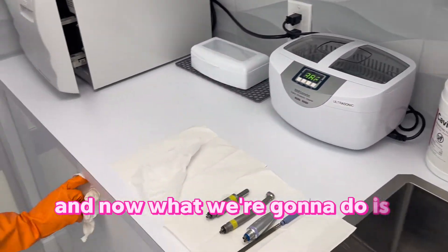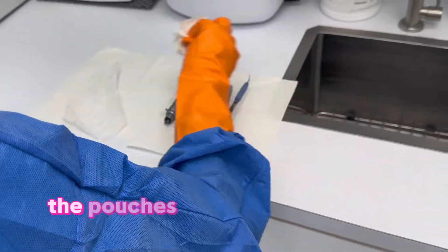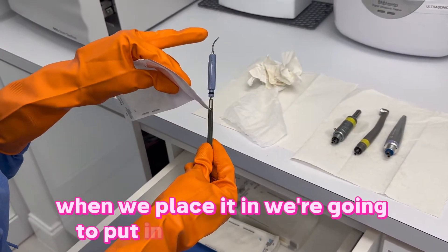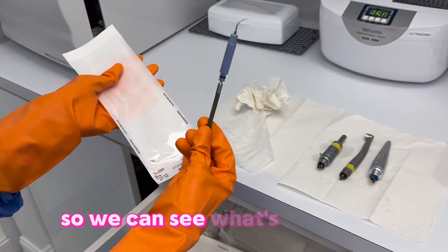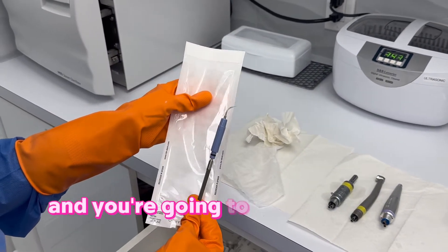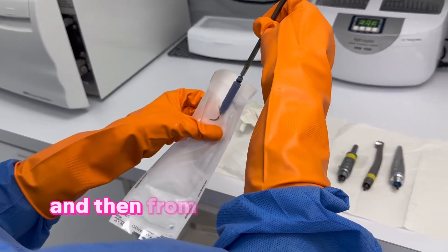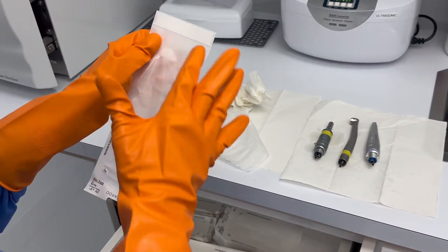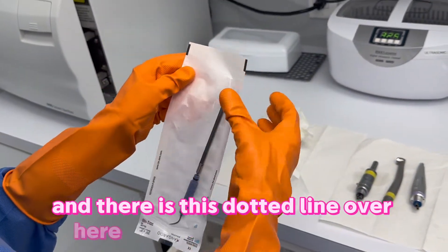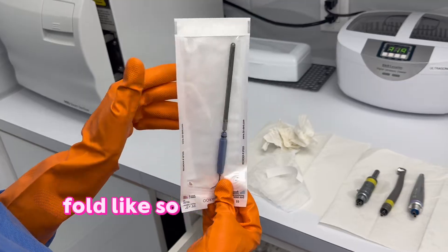Now we're going to bag the instruments. Here are the pouches — the way that we bag is in groups. When we place instruments in we're going to put the working end in first so we can see what's in the bag. To open the pouch, hold it with your left hand and open it with your other hand. Drop the instrument in, then at the dotted line you're going to fold it — that's how you bag your instruments.